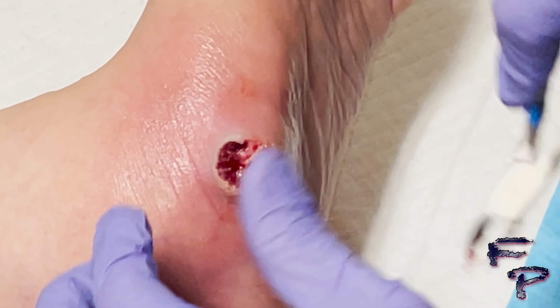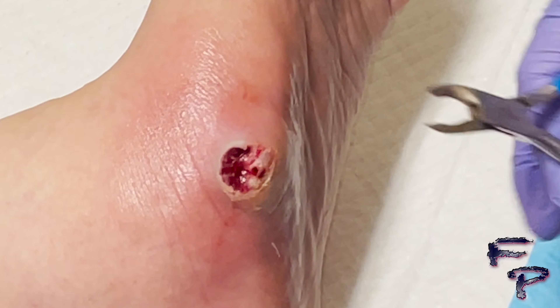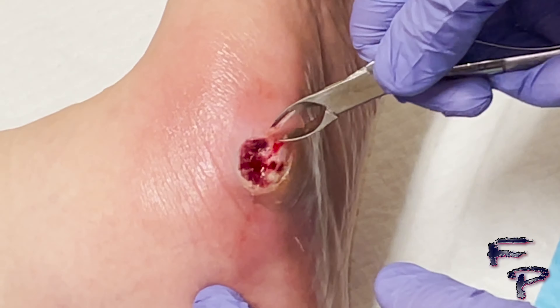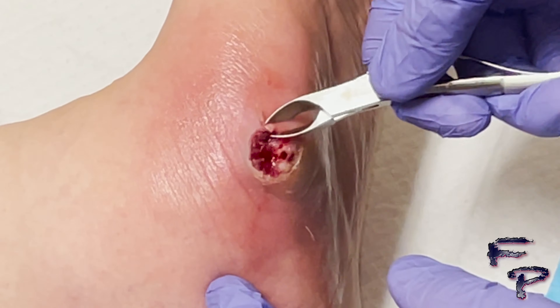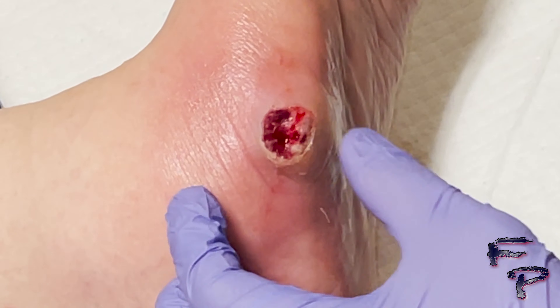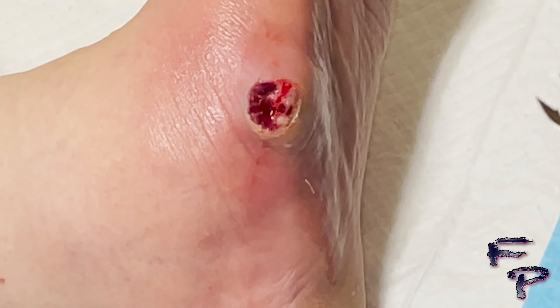Here, with trimming out the subcutaneous tissue carefully, I notice a focal central tunnel, which I would display here — right there — so it is still tracking plantarly.